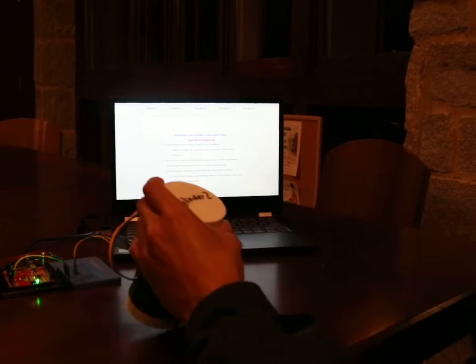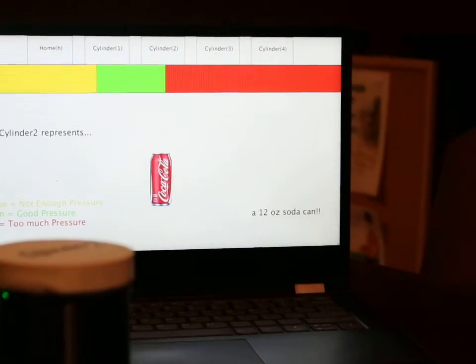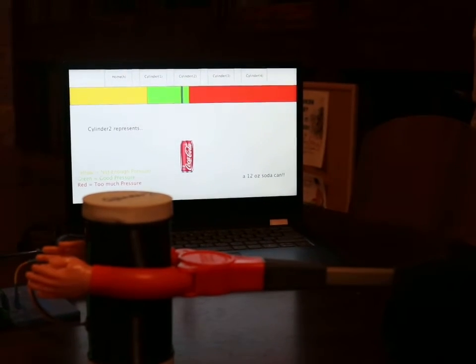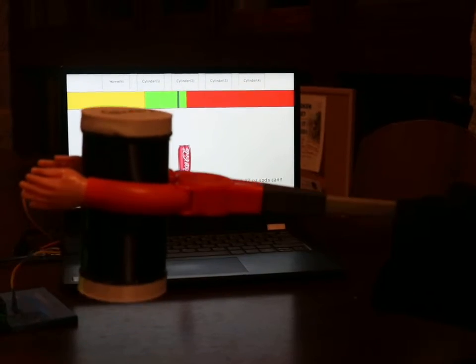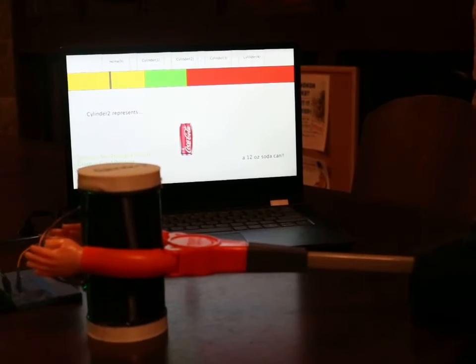To get started, insert the desired tube into the breadboard and choose the corresponding page that matches with the name of the cylinder. And once we are on the page, we will then grip the item and grip it until it gets to the green area, which is the correct amount of pressure. We will lift it up and then place it back down.